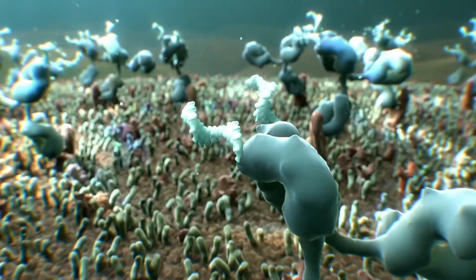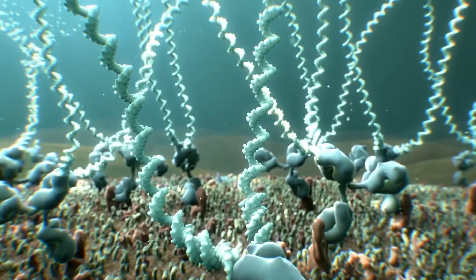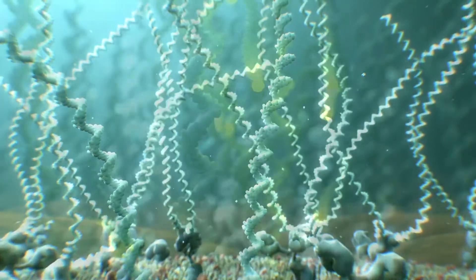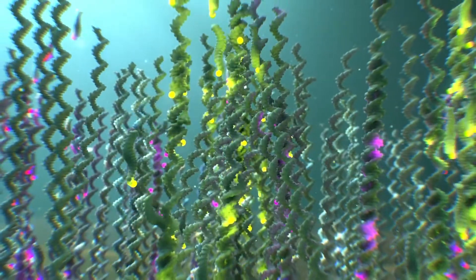The barcodes on each marker are then amplified in a single step, allowing for the ability to visualize and differentiate the expression ratio of each marker within the panel. The amplified barcodes are then decorated with dozens of complementary fluorescent probes, dramatically enhancing the sensitivity of InSituPlex.